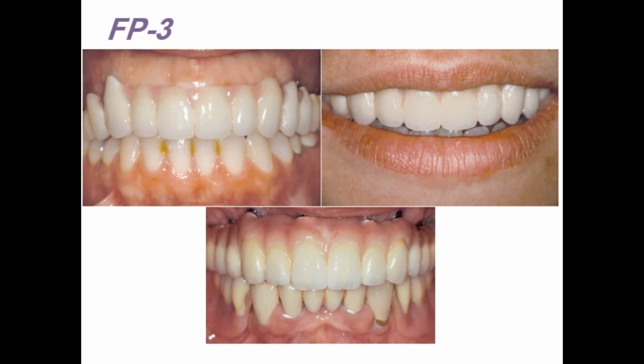FP3 or type 3 replaces missing crowns and gingival color and portion of the edentulous site. Prosthesis most often uses denture teeth and acrylic gingiva, but may be porcelain to metal. Here, an intraoral review of this FP3 restoration shows how it replaces the interdental papillae with pink porcelain. The high lip line during smiling shows the interdental papillary regions in the anterior maxilla. The fixed prosthesis should replace the gingival regions in the aesthetic zone by soft tissue surgery or with the final restoration. Here an FP3 prosthesis with pink porcelain.